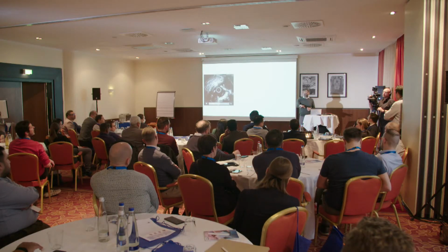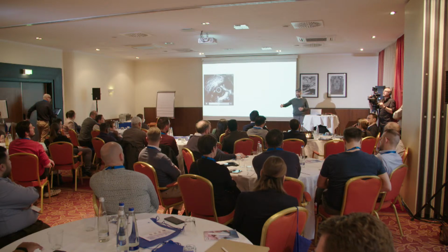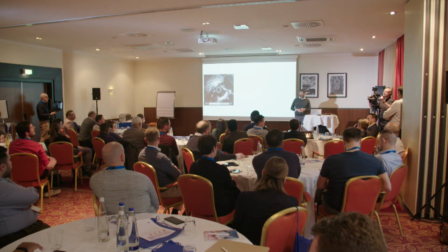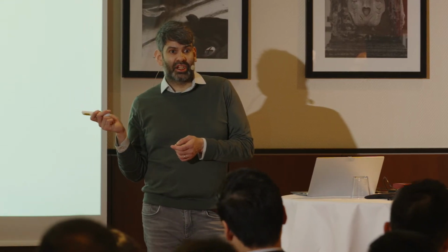Oh, definitely smaller, yeah, because by definition, you should have oversized the IVL balloon by at least 10%. So yeah, your post-dilation will be smaller than that. Though sometimes, as with that tibial case that I showed you, even just after post-dilating to 3 millimeters, those little cuffs of calcium have been thrown off and the vessel opened out to close to 4. I didn't balloon it to 4, but once the calcium has been changed and it just pushed out a little bit, it opened to that.